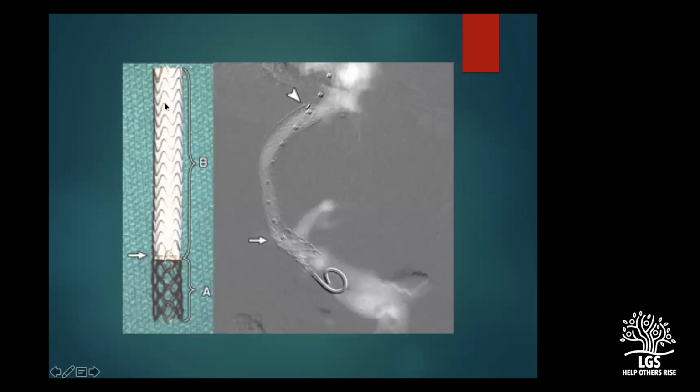So this is how the TIPS stent looks. The one which gets inside the hepatic vein is a covered portion. The one which gets inside the portal vein is actually the bare stent. The reason we have the covered portion is to avoid the neo-intimal hyperplasia, or smooth muscle hyperplasia, because of the leakage of the bile juices inside the liver.